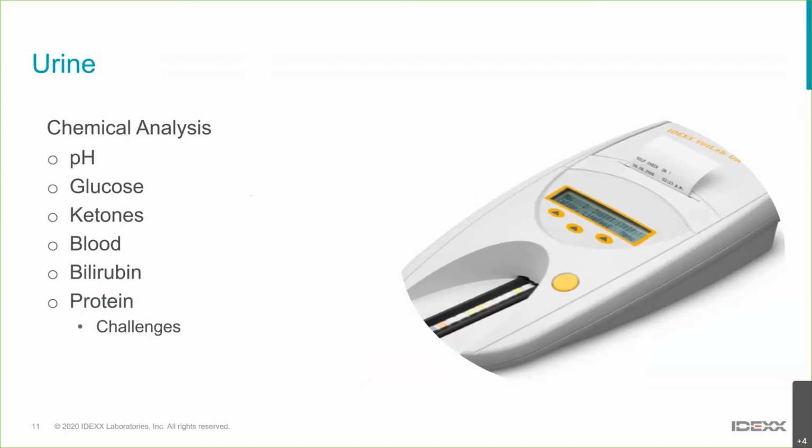Primarily ketones we think of in the situation of complications with diabetes like ketoacidosis or at least ketonemia. Even though there are the three ketones in the blood, the beta-hydroxybutyrate, the acetone, and the acetoacetic acid, we're only detecting the acetoacetic acid and acetone in the urine with the strips. But we can occasionally see ketones with catabolic diseases, very high protein diets, and things like that.